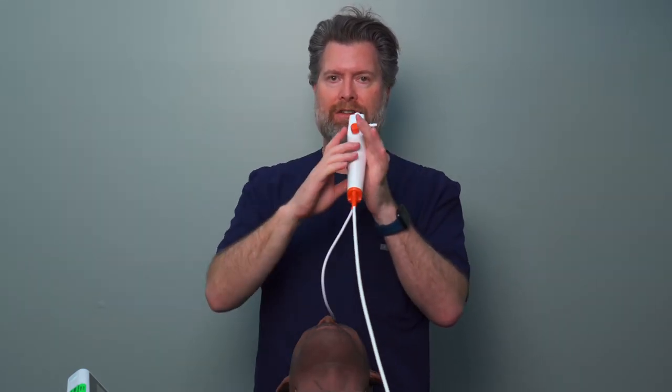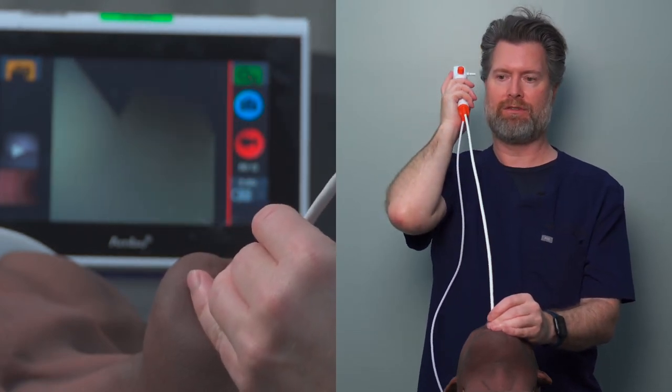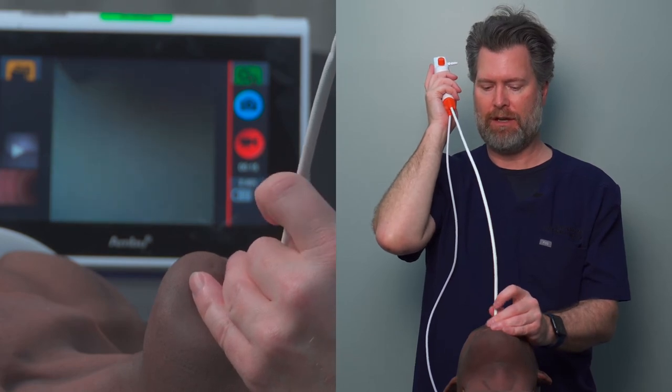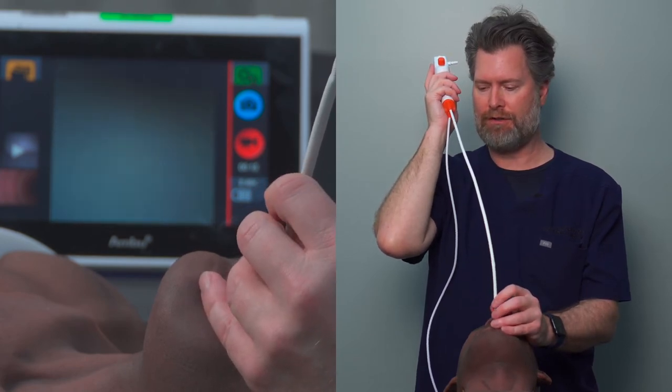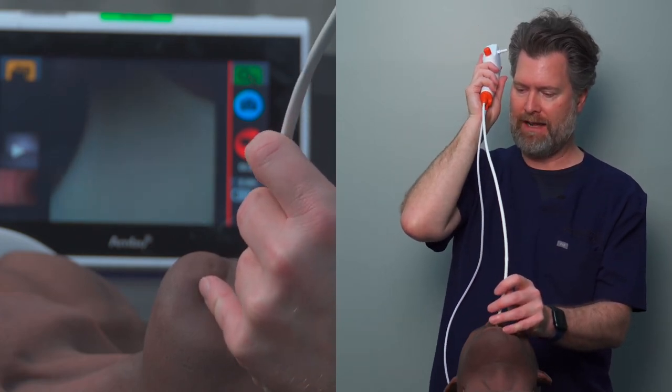Once you have the Williams Airway in place, pick up the scope in your dominant hand. People sometimes think it should go in the non-dominant hand like a laryngoscope, but you actually want it in your dominant hand because you'll use it for fine motor skills. So insert the scope, bend your elbow, rest gently on your shoulder, get a good position. Now use your fingers to walk the scope down — you can see we're on the ramp of the Williams Airway.